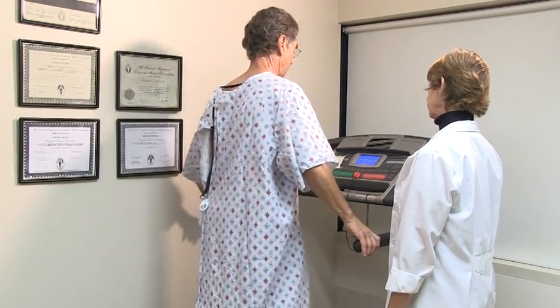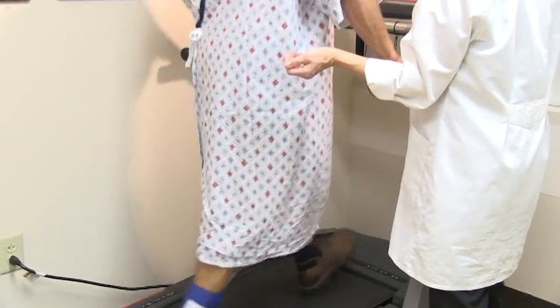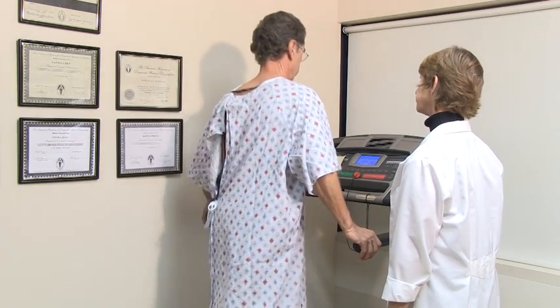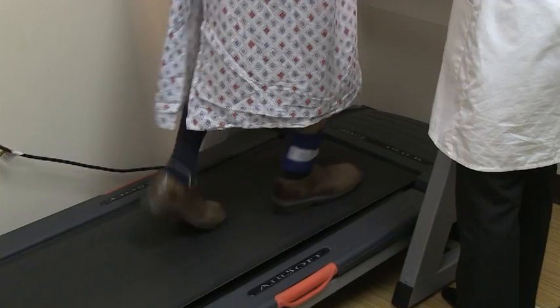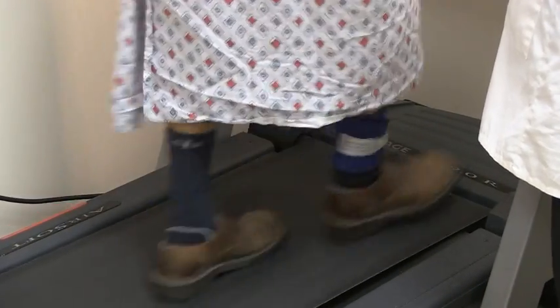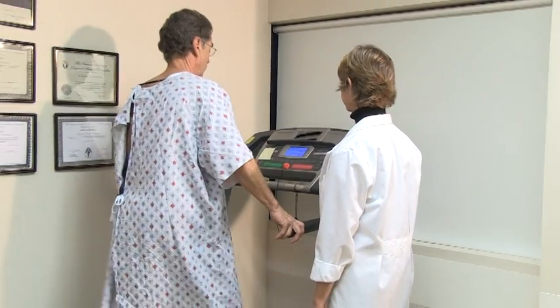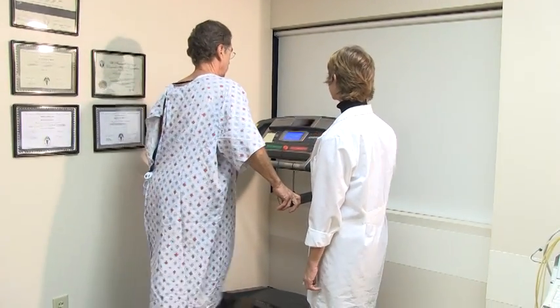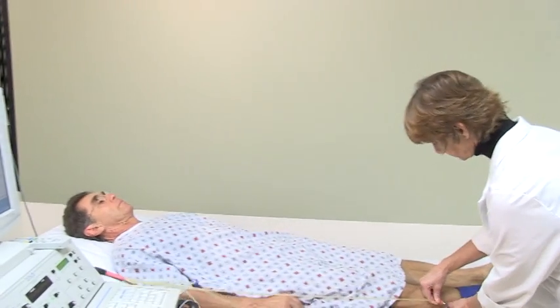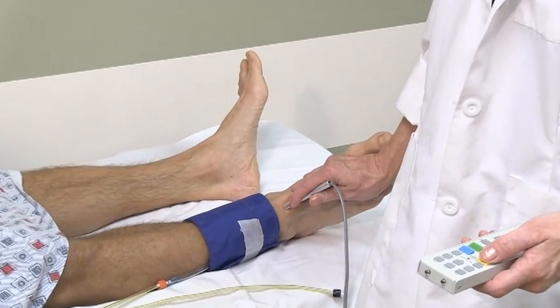Sometimes your doctor may request that you walk on the treadmill. This is an exercise or stress test, which is different than the one you may do for a cardiologist. You will walk at a pace that is comfortable for you for up to five minutes. If you need to stop for any reason, the technologist will end the test right away. You will then lie down on the exam table again, and blood pressures will be taken at your ankles and your arm.